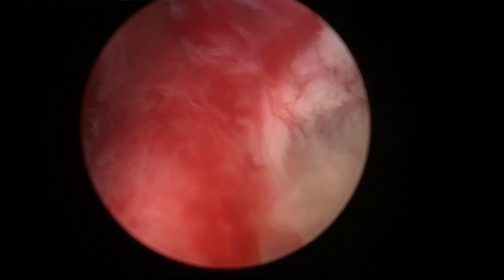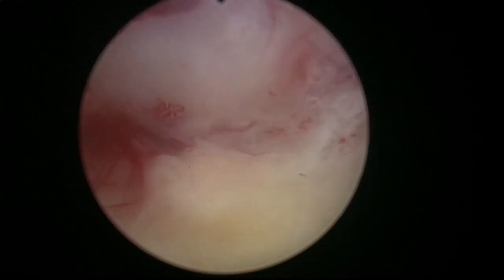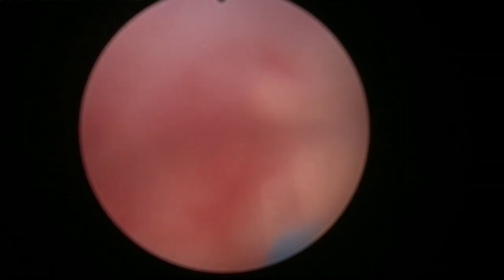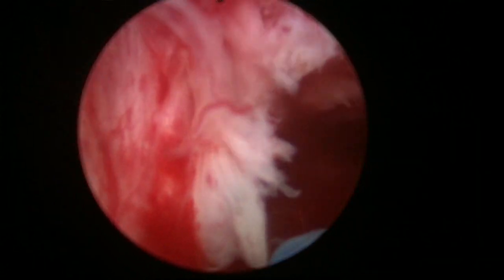The typical maneuver to enter the proper plane is to put the scope very close, in close proximity to the veromontanum, and then push a little bit sideways, lateral. But you can do a little bit of mechanical dissection at the apex. That will give you the clue of where is the good plane. Of course, when you have localized the plane on both sides, it's only logical to try to connect them in the midline. So you cut on top of the veromontanum.